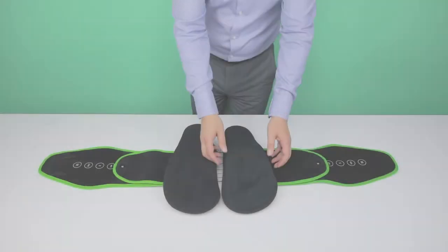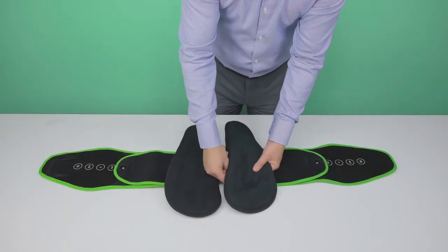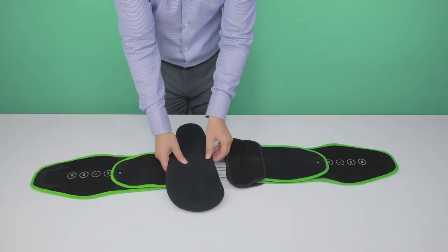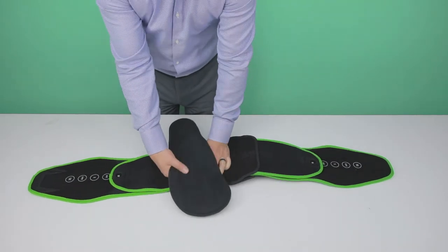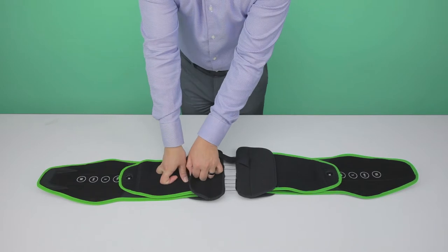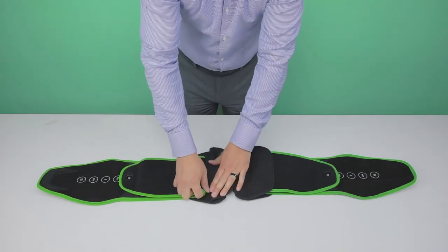Turn over the brace and remove both independent posterior panels by detaching the Velcro and sliding them off the belt. Detach right and left soft panels by opening the center clamps on each side of the brace.